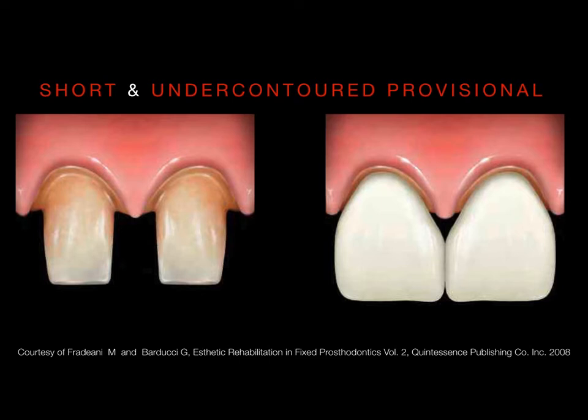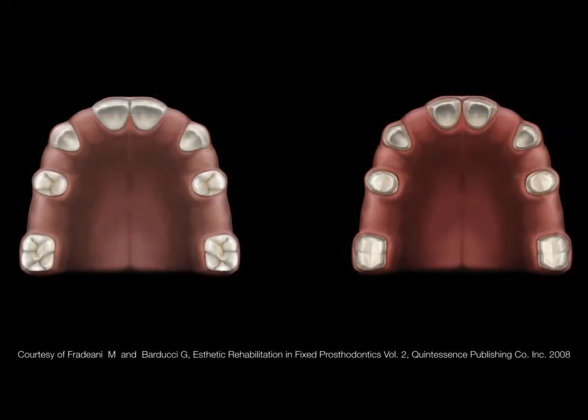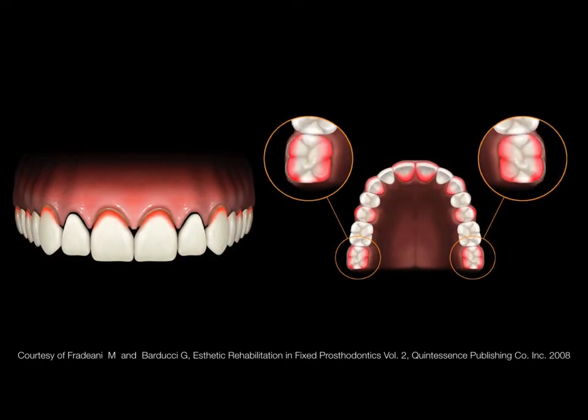So now let me explain that when you have a large, extensive case like this, the problem of acrylic contraction is much more visible. It's not like one central incisor, but one entire arch. If one entire arch is involved, you can easily see sometimes a problem like that. It means that the provisional shell doesn't go completely in, and sometimes becomes completely inclined. The occlusal plane becomes slanted, and that is not of course what we love to have.